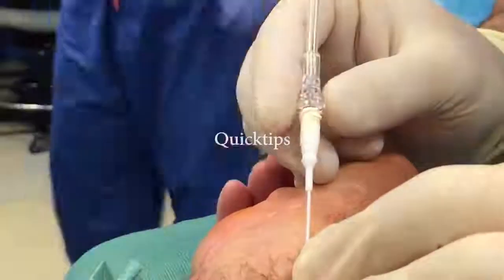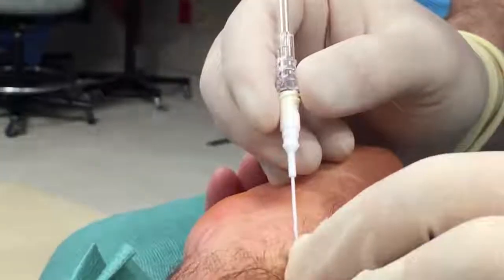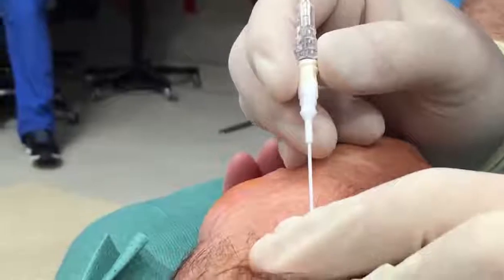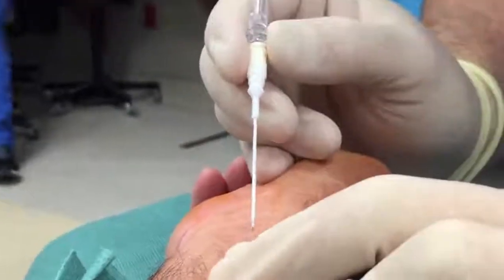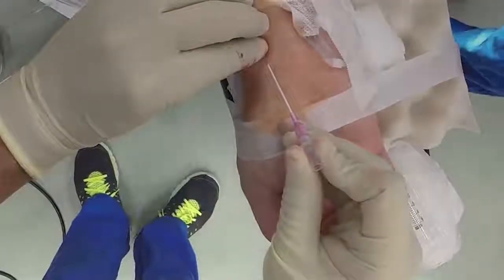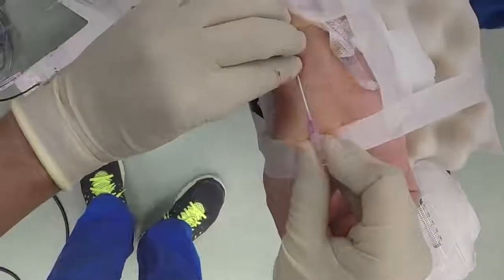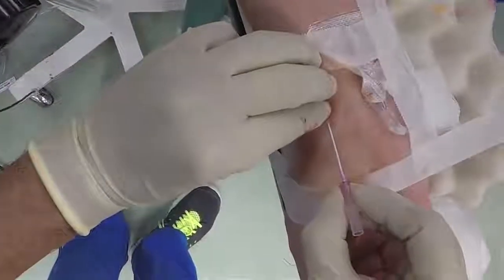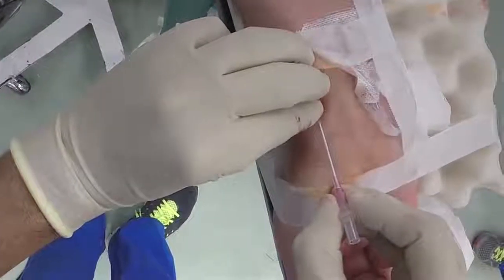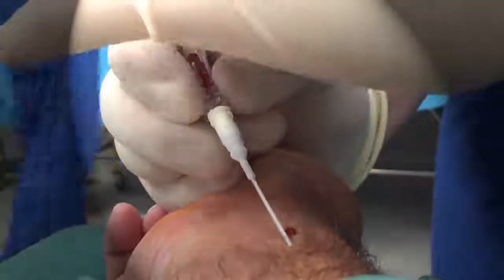You already know the two biggest ones. Wait for a rising column of blood, and make sure there's no resistance in the guide wire. Randomly stabbing the forearm is an inefficient way to find the artery. Also, by fully removing the catheter from the skin, each attempt increases the risk of clogging your catheter. Instead, organize your attempts. Create a map in your head and slowly shift the catheter a couple degrees each time. Withdraw the catheter almost to the skin before changing your angle. Your patient will thank you also.